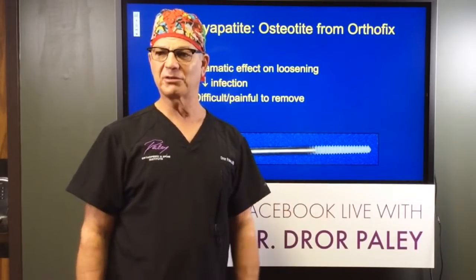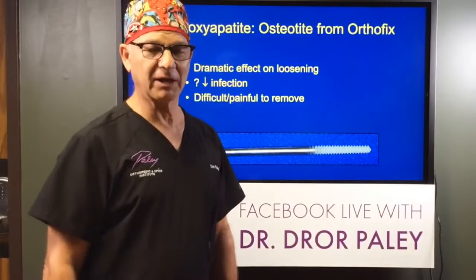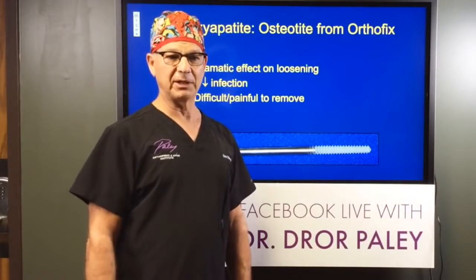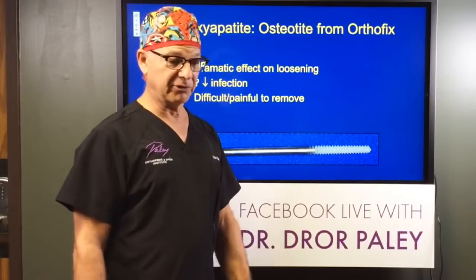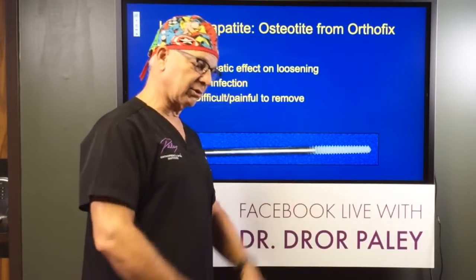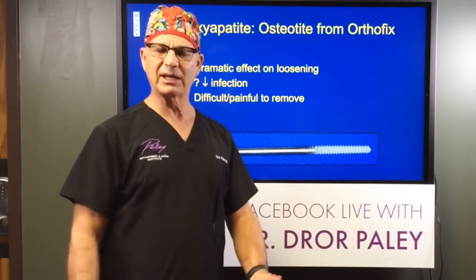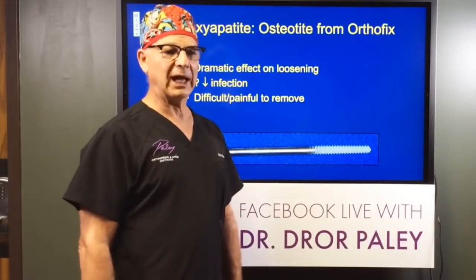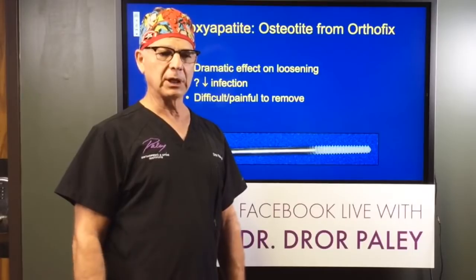So a company called Orthofix came out with covering the end of the pin, the threaded part, with what's called hydroxyapatite, which is the mineral that's inside of bone. So it fools the body into thinking the pin is made of bone, so it attaches to the pin instead of moving away from it. If it's just pure metal, it often moves away from it. So, HA coating. And I helped a company called Smith & Nephew design their pins, HA coated.